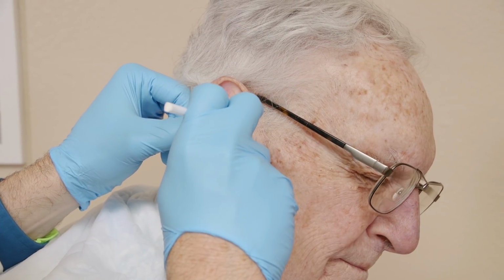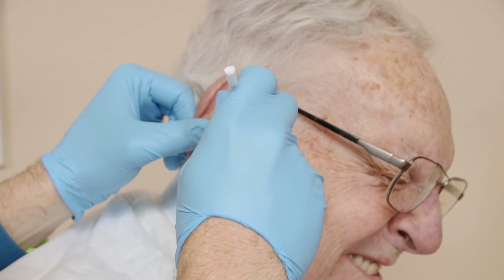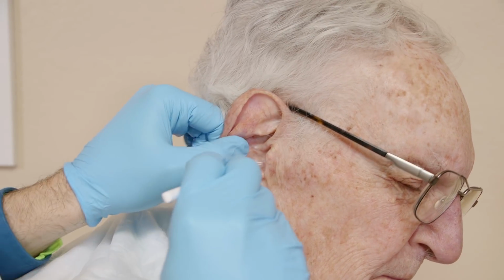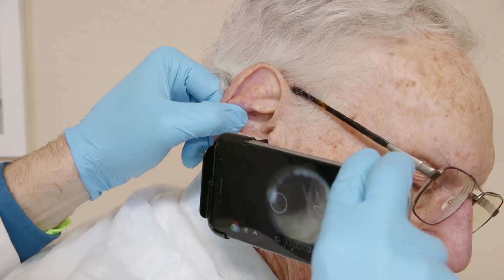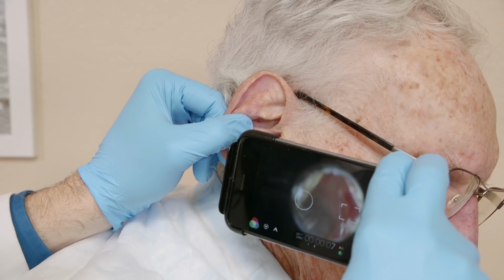It's right there. And it's just the tiniest little bit. It's just that it's right on the edge, so it sticks out. And he is sore there. So we're going to check that edge. That looks cleaner. That looks better. Okay, good. We're at a good place now.